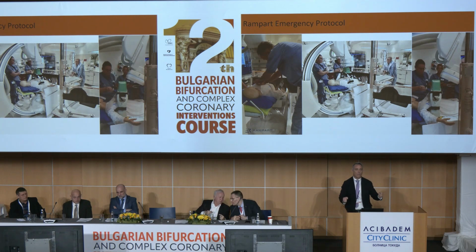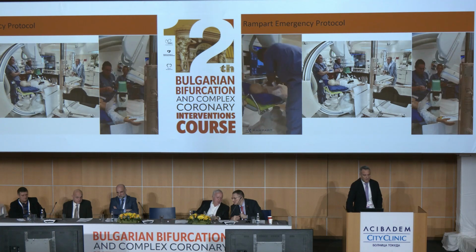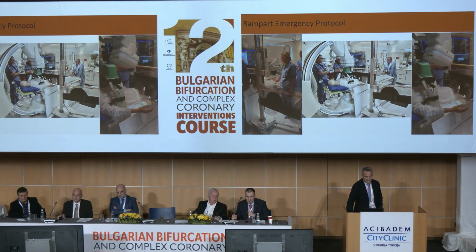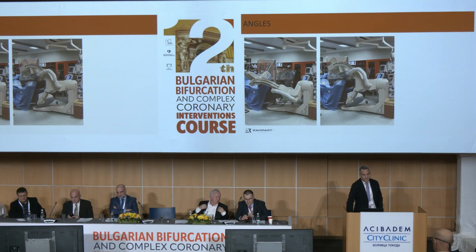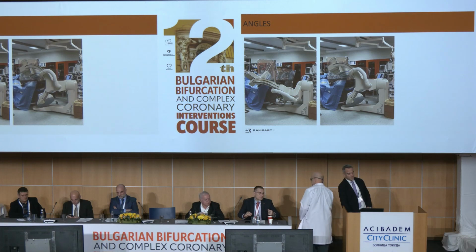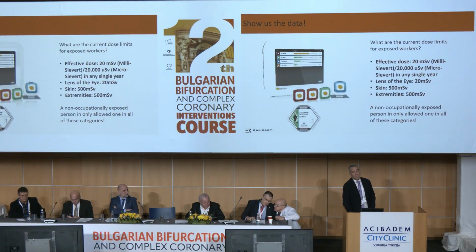You can move it back and forth; it's not a fixed thing, but movable. So basically, you can do every kind of procedure. You can do CPR, and also use the Lucas and things like that. You can also do really tough angles, and it doesn't much bother the protocols.